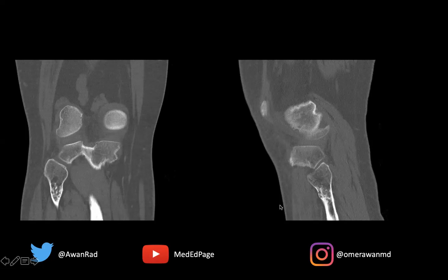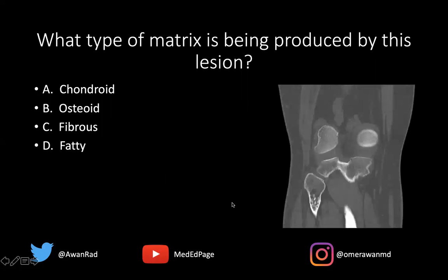This endosteal scalloping could be a harboring sign that this is not in fact a simple enchondroma, but maybe a low-grade chondrosarcoma — just important to keep in mind. But the answer to this case is, of course, chondroid matrix.